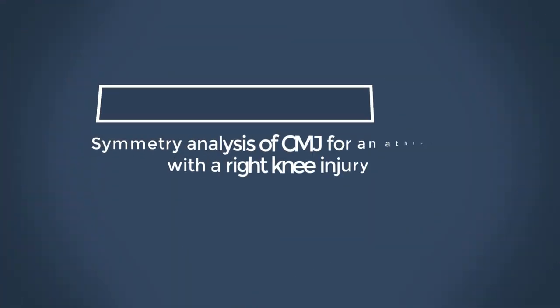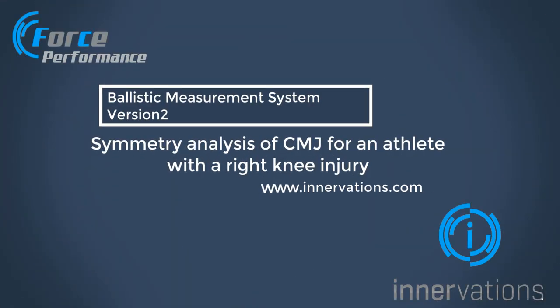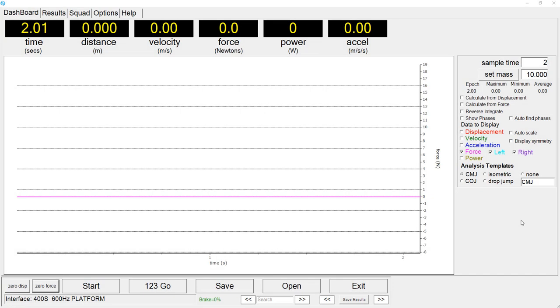In this video, we demonstrate symmetry analysis using a single force platform. The athlete is performing a counter movement jump and has a right knee injury. To switch on the symmetry display, check this box and the symmetry index is displayed.